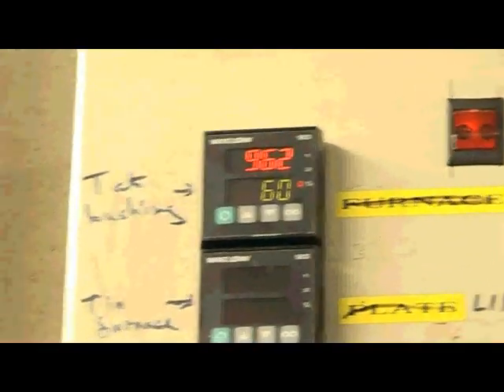That's our furnace and it's currently at about 960 degrees C, almost up to a thousand.